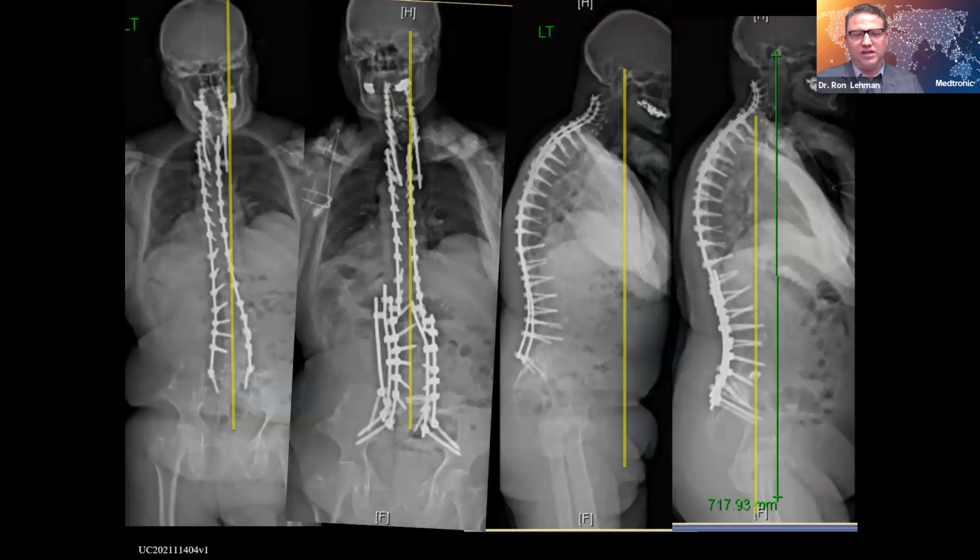And so you can see we dumped all the rods we had in the hospital into his spine there. We have 5 rods going across that lumbosacral junction. Used the robot to place screws very accurately and very quickly in his fusion mass. And then used multiple dual-headed screws, as you can see here too, to really link these up side to side. So it's a really nice application to do.